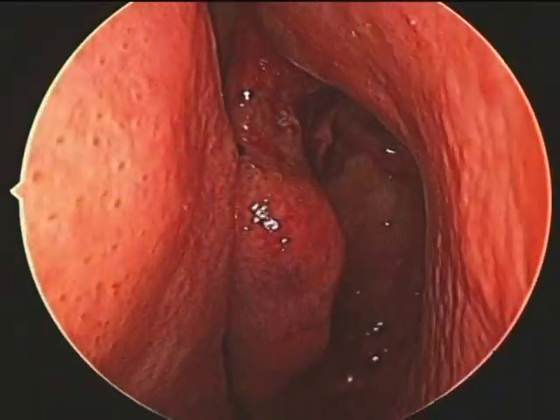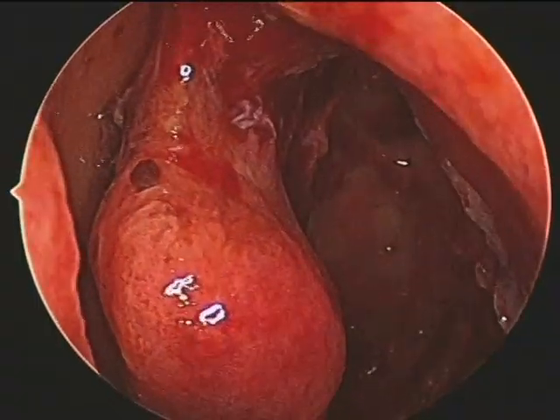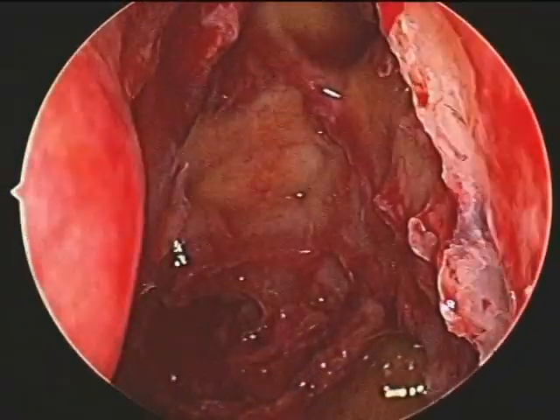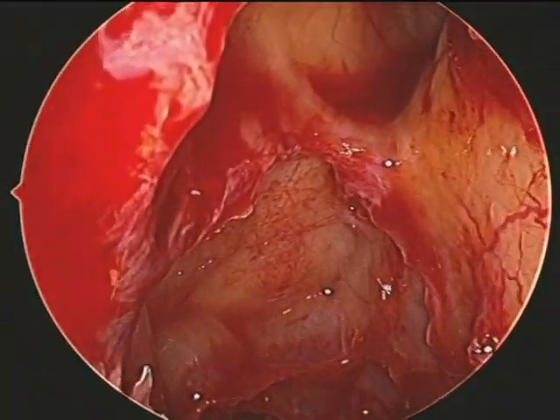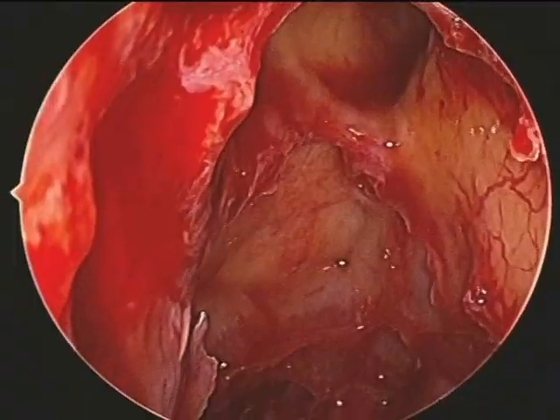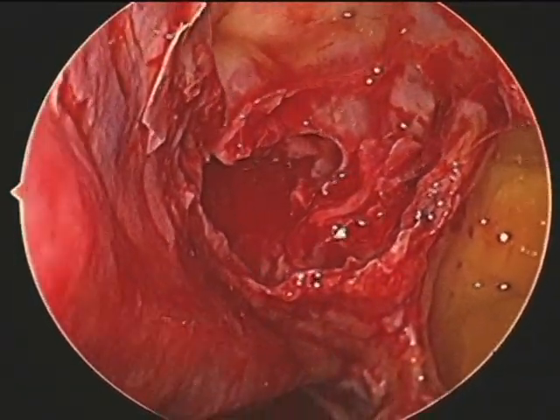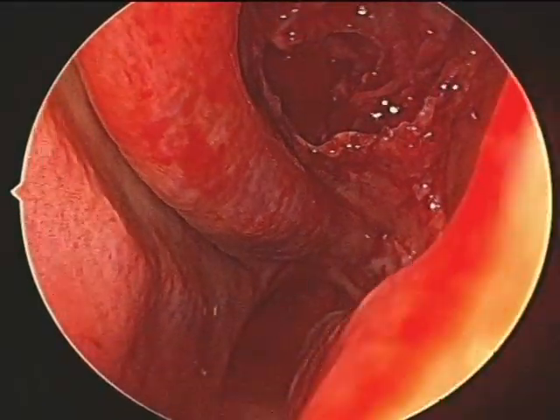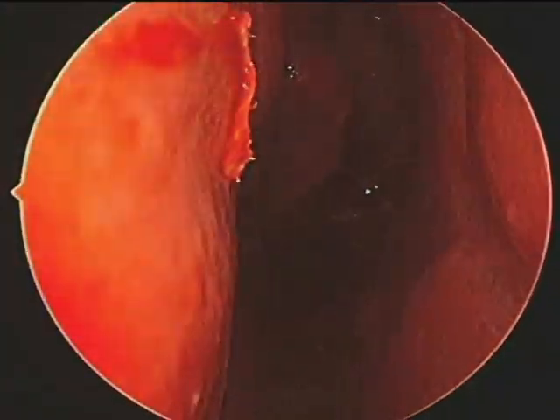We look out for bony spicules, bony remnants, and diseased mucosa — you can see the surgical cavity is clear and clean. That is the anterior ethmoid artery at the upper part of the view, the frontal sinus, anterior fovea, posterior fovea, the sphenoid sinus os, the left maxillary sinus, and the nasopharynx.